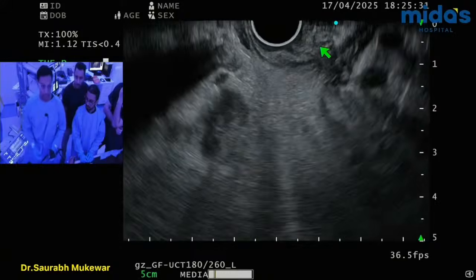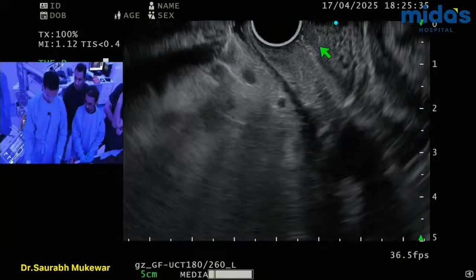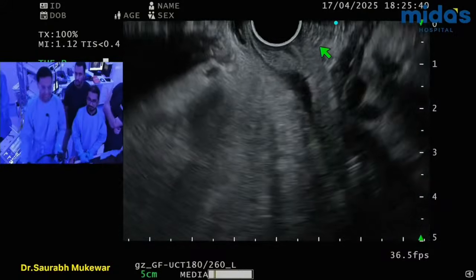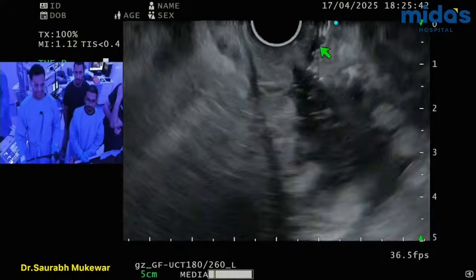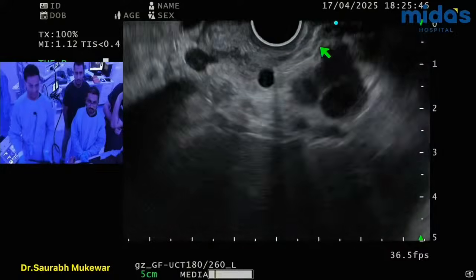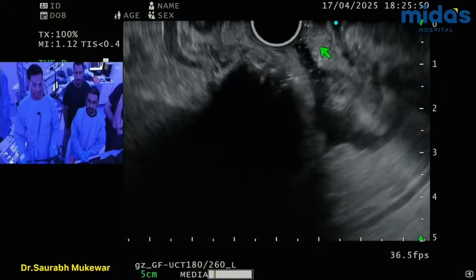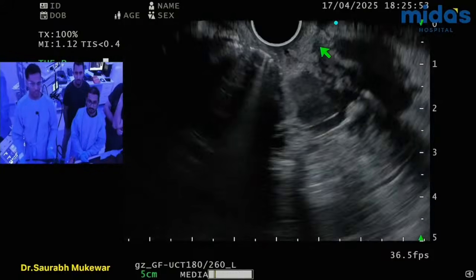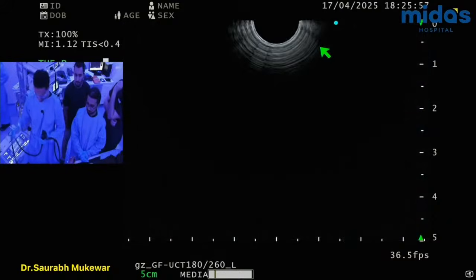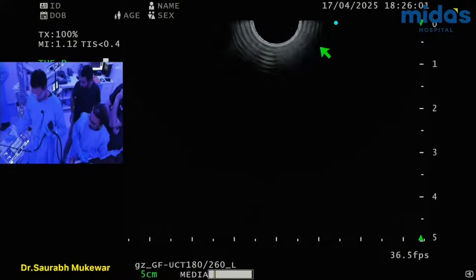Okay. Just to pack it better. It's just your feeling that you need, which comes out of your practical, your previous experience. Yeah. See, gone. The whole thing is gone. Outflow, we'll see. Yep, that's it. I won't have to do anything. Just check the scope, guys. Check the scope.